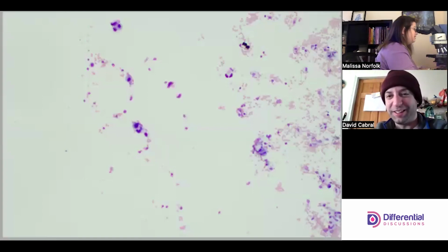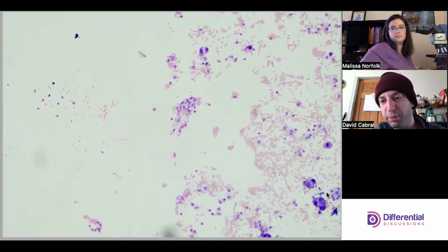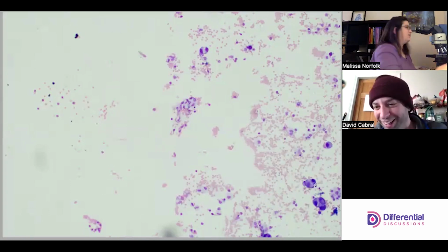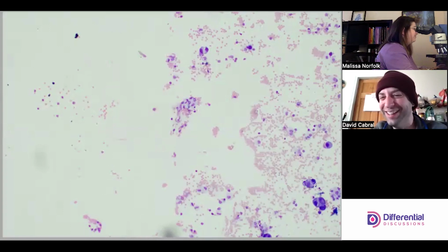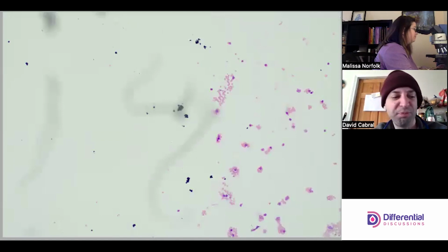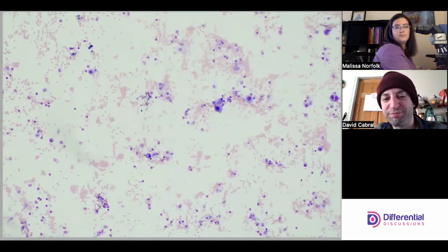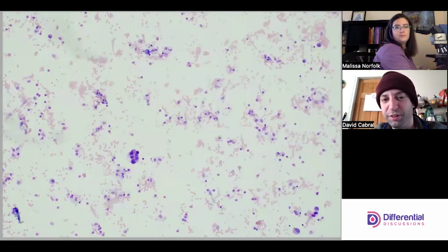Well, let me scan. So we're being diligent microscopists on low power, looking around. Cool. I see some colorful big stuff. Not liking that already. I'm always hesitant to do too much description at low power like this, but that nucleus looked like it had a hole in it. It's not good.